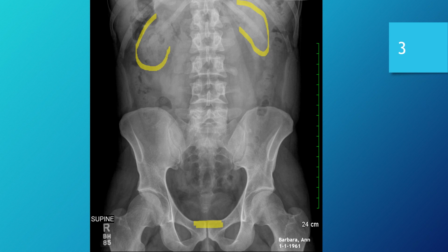It's a bit difficult to determine for certain on the left side if the entire kidney is present. And because of that, we cannot make assumptions. We need to make decisions based on what we do know. And what we do know is that we have quite a bit of leeway on the inferior portion of this x-ray.